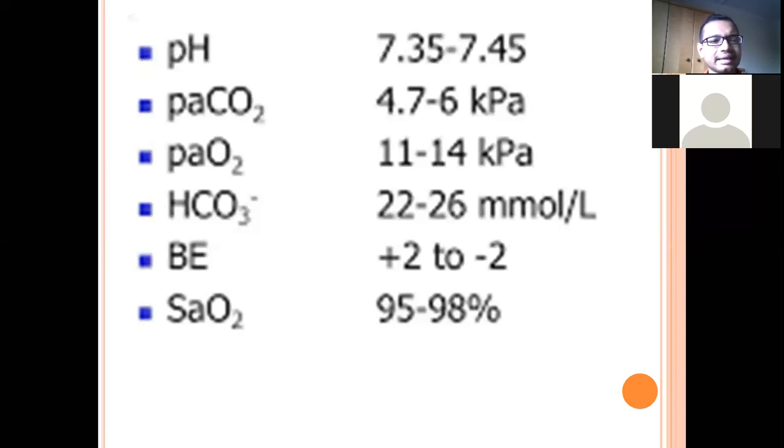So we think of a person on no additional oxygen, that means on air, so it's 21% oxygen. To remember how much oxygen is normal for a person who is just breathing normal air at 21% oxygen, just subtract 10. So 21 minus 10 is 11. So the normal level for a person who is not on any additional oxygen is 11.